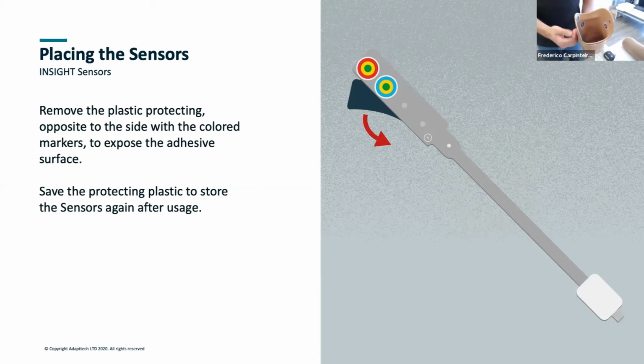You make sure that the outside is also adhered to the socket, and then you bend it properly around to make sure that you get the best borders possible when you get the scanning done. Removing is the same way, just pull it and they will remove. Next slide.